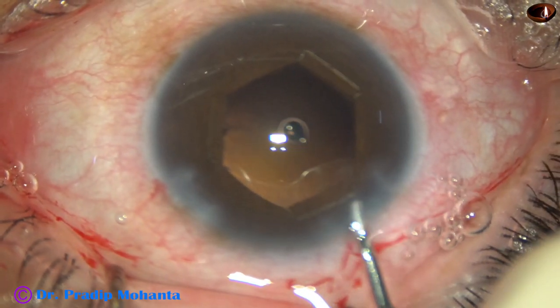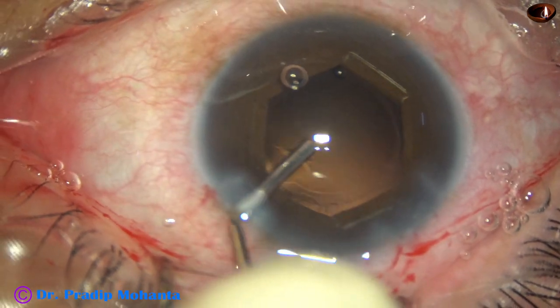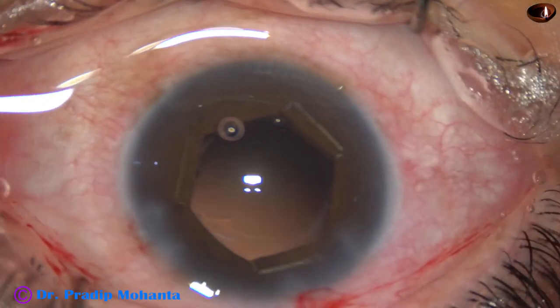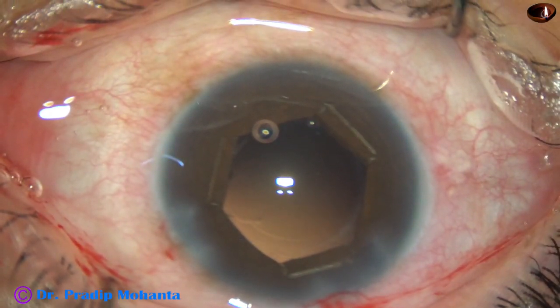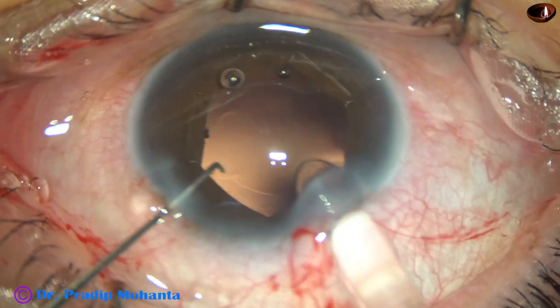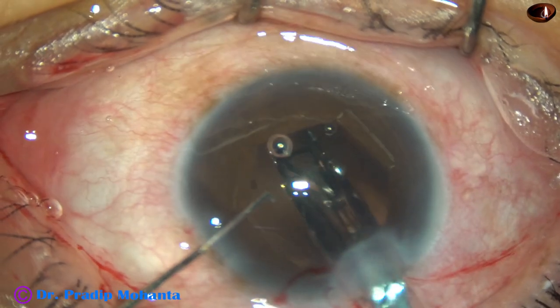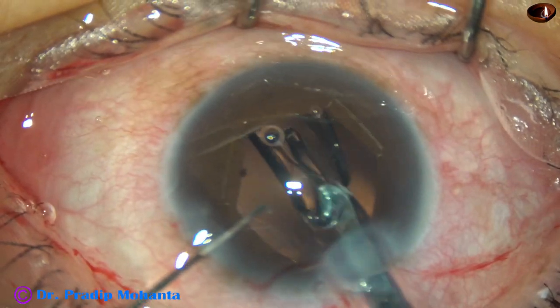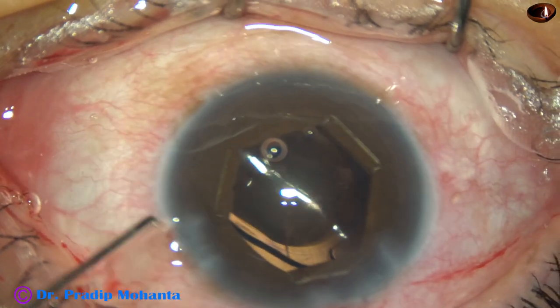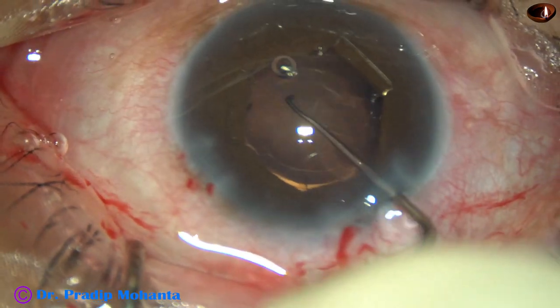Now I fill the anterior chamber and capsular bag with visco and then implant a single-piece monofocal intraocular lens. Yes, the lens has gone into the capsular bag.